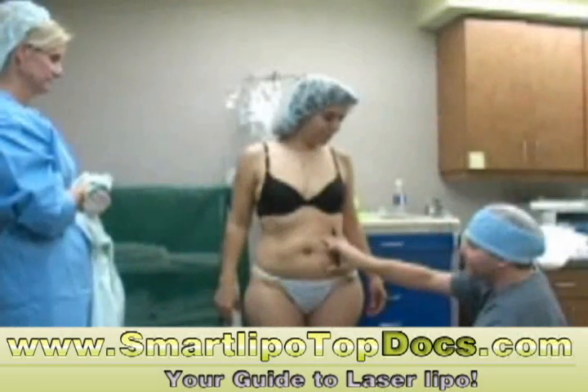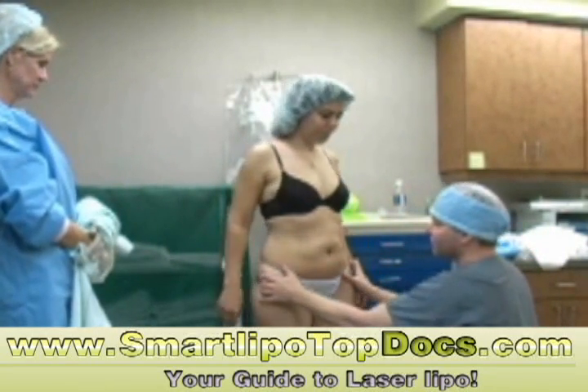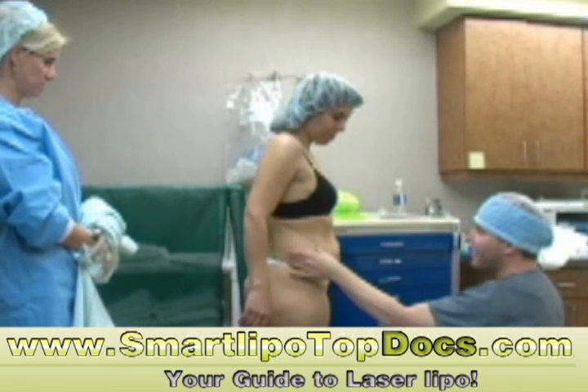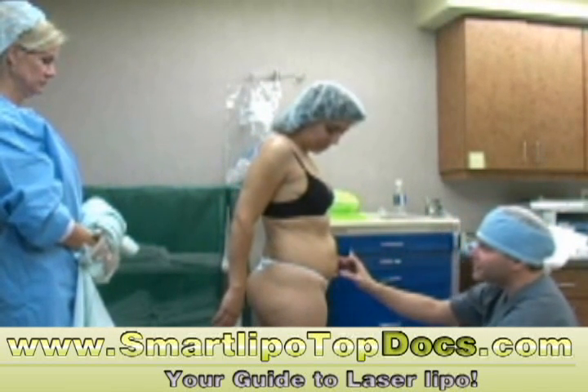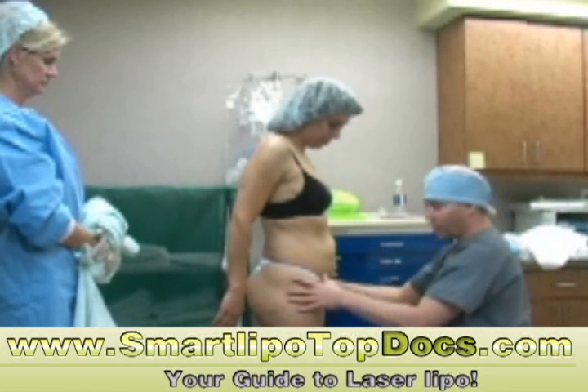So when we take this down, it may look a little odd unless we take down your hips and waistline as well. So turn to the side here — this is the fat pad along here that I'm talking about. Usually when I do an abdomen on a woman or a man, I like to include the waistline and the hips because I think it brings things together nicely. So we're going to mark on you here.